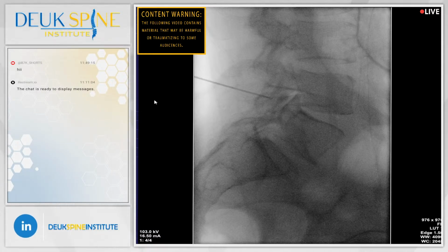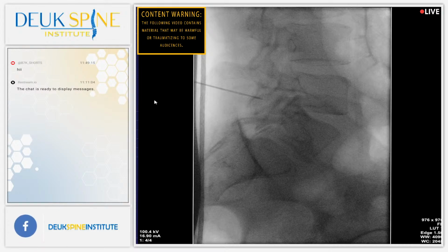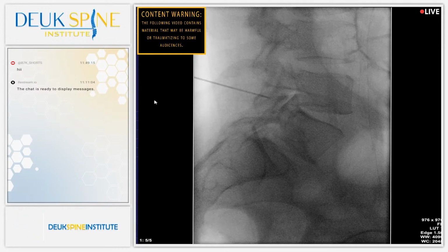but I feel like 5 may not be there yet. Maybe go a little further. Let's just see if we go further what happens. More. Yeah, we're definitely going the other direction now. So we shot past it. Let's go back. And back a little more.